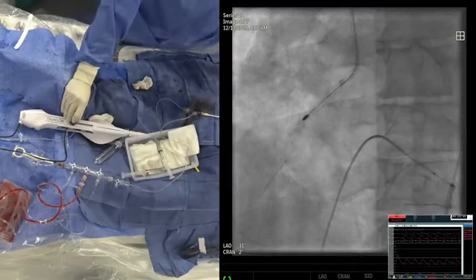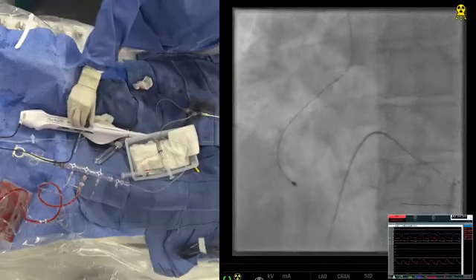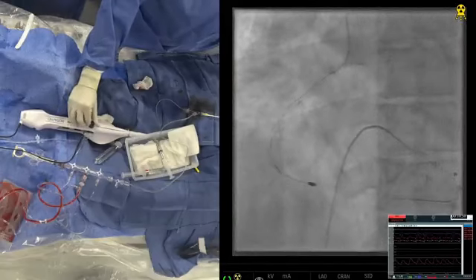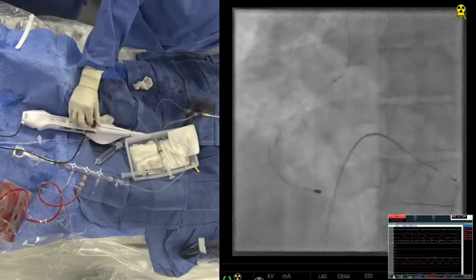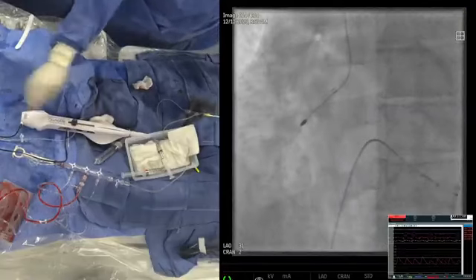There's no ST elevation in the native leads, non-pacemaker leads. 130, 30, 5 seconds, 25, 30, 10 seconds, 30. No, you did not cross the distal lesion yet. Yeah, we have to just do 1, 2.